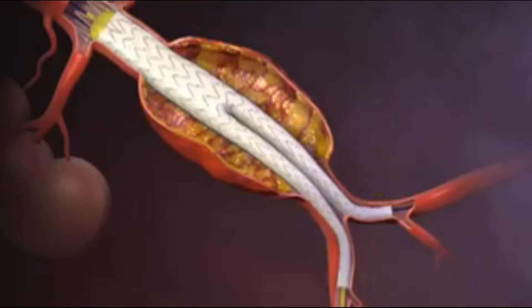Finally, the sheaths and guide wires are removed and the femoral artery is repaired. Aortic blood subsequently flows through the stent graft.